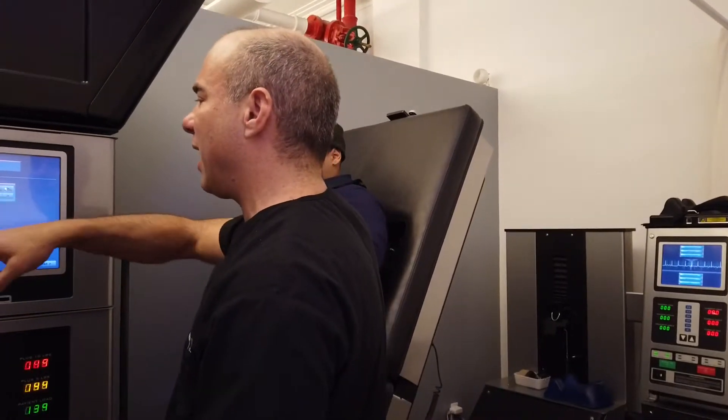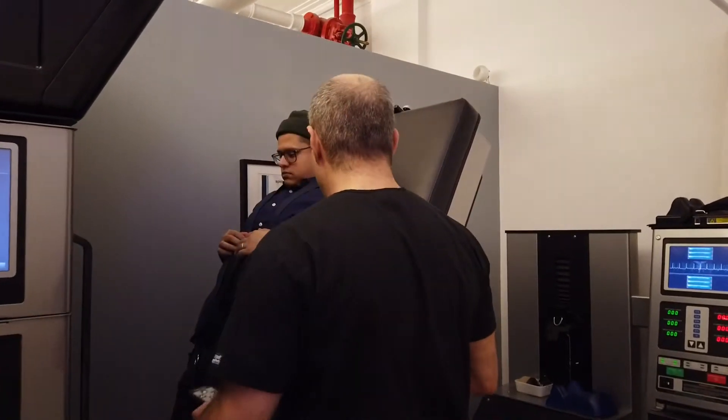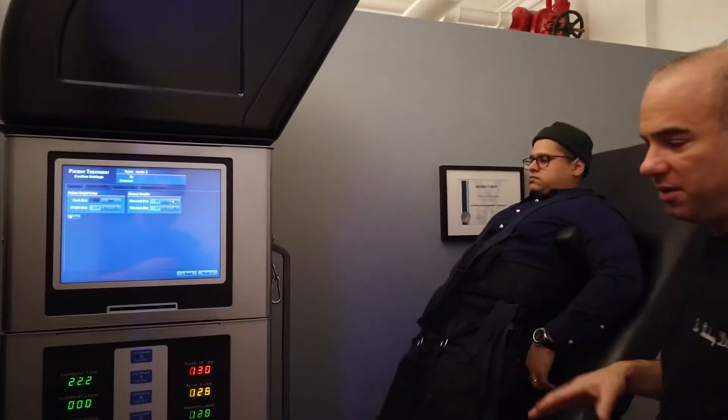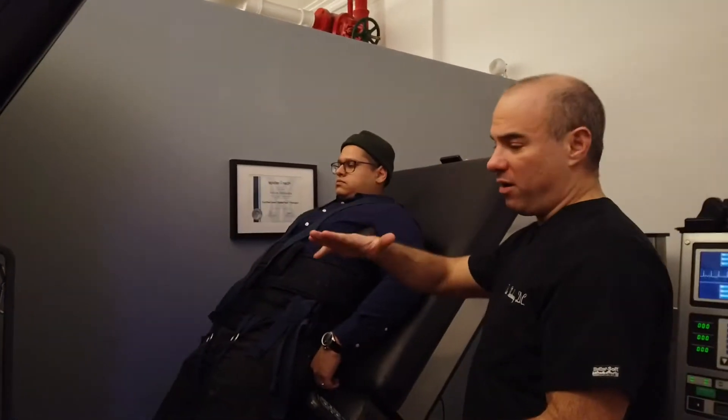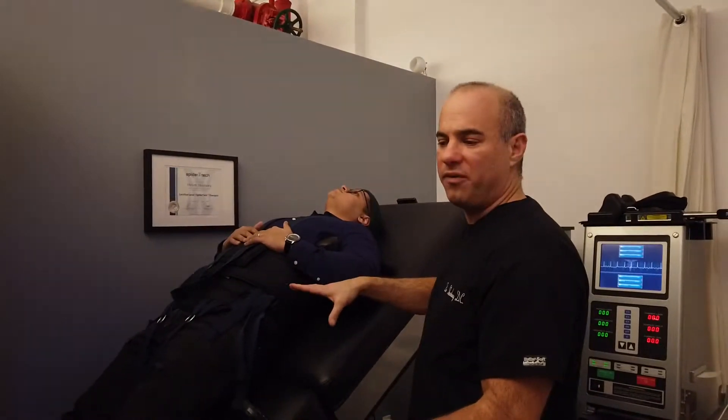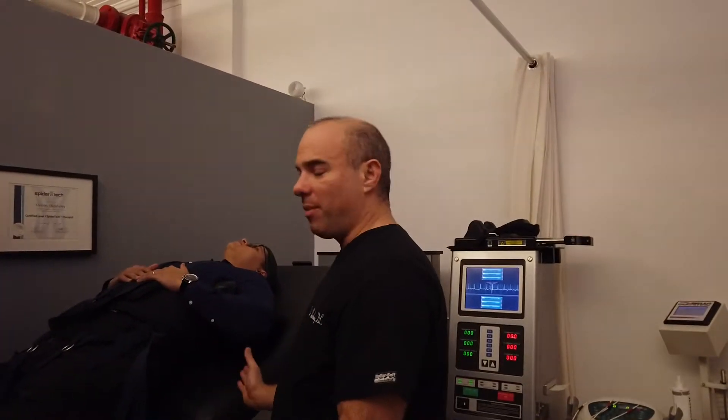I'm entering the maximum weight and the time, and I'll bring you down. What's unique about this table is the Trendelenburg up and down, which makes it a lot more comfortable. As we progress through care, people are going to be a little sensitive coming off the table, so it's a lot better than getting up by yourself — having the system bring you back into a gravitational environment.